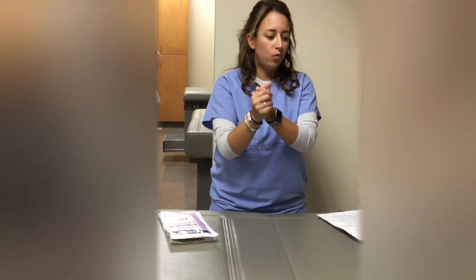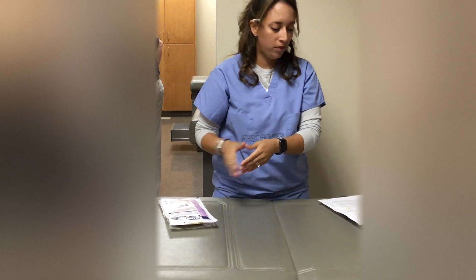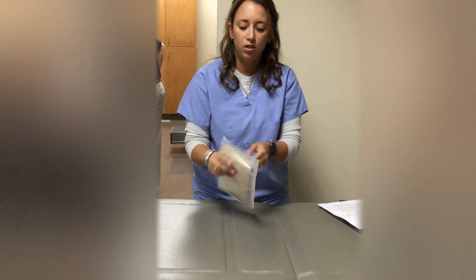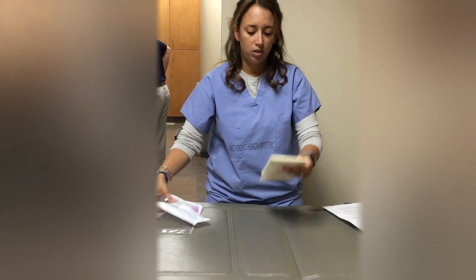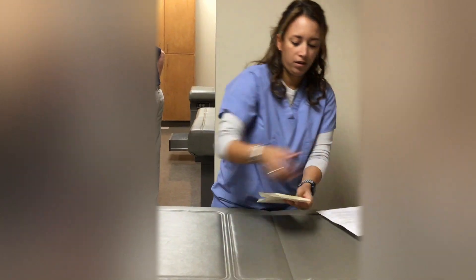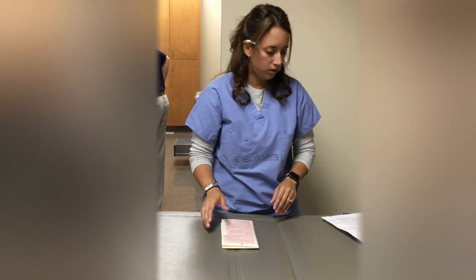I'm going to wash and dry my hands, making sure that they're dry before I open the package. I'm going to grab my package, open the outer package, grab the inside package, and set this out of the way — set this on a smooth, level surface.